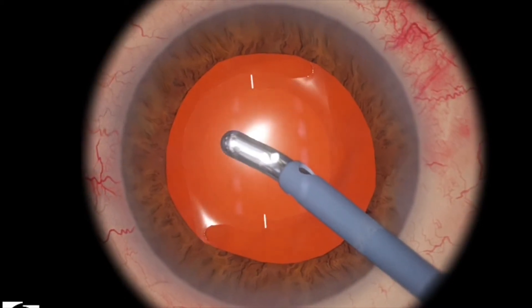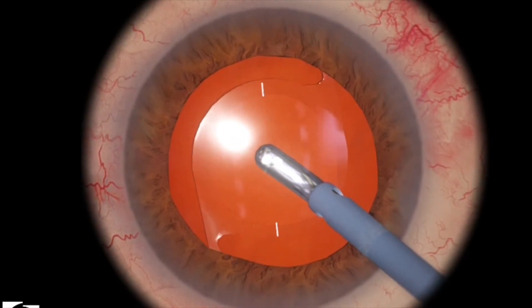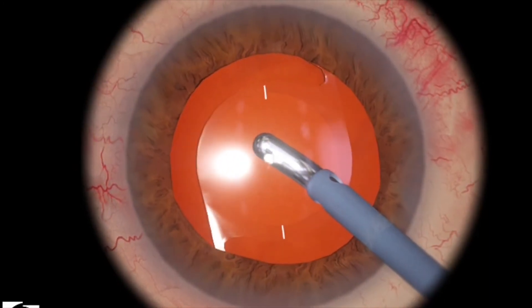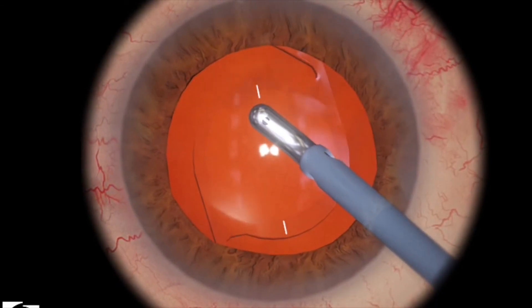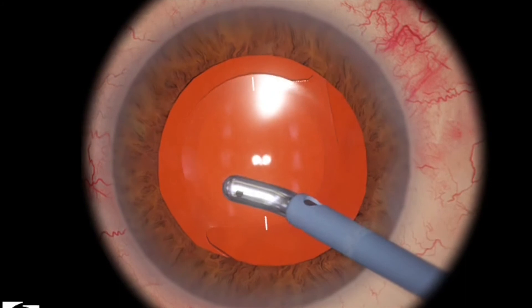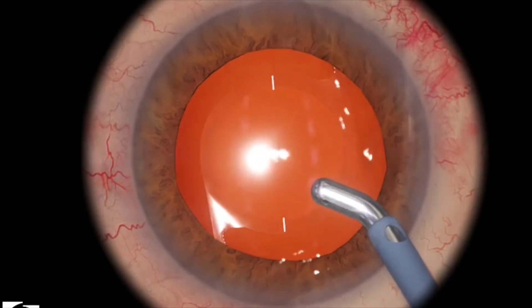I'm just pushing down on the lens to try to get some of the viscoelastic to come to me. And then just moving my IA tip side to side to try to get some more of the viscoelastic. If you don't remove all the viscoelastic, the machine will deduct you points from your final score.